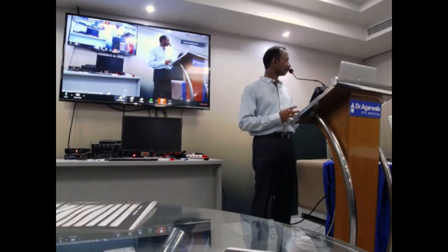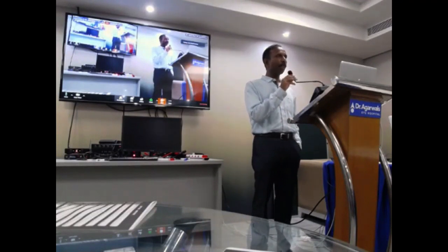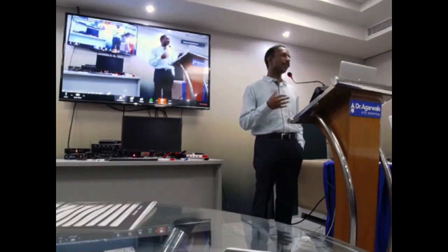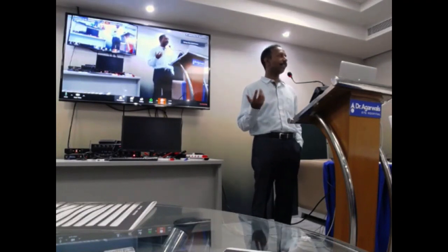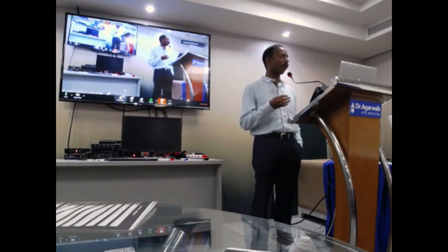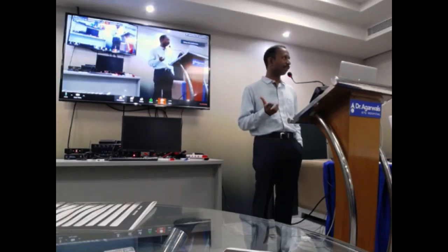We have one question from our online viewer. eSight, the indications and what kind of vision improvement will a patient get with it? In terms of the vision improvement, let's assume the patient has a vision of 6/60. With maximum zooming, which we have done trials with, the patient may be able to improve up to 6/9 or even 6/6. The difficulty with eSight is not in terms of the improvement in the vision, because the zooming capacity is up to 24 times.